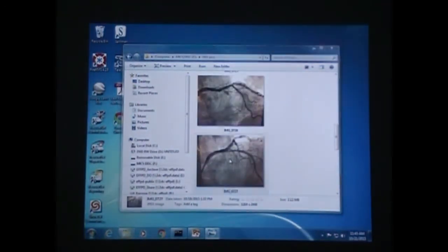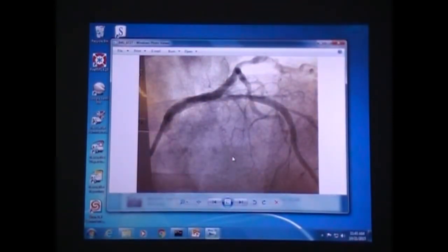So here's another angle, and it's really hard in the cath lab because you think that patient's laying on the table flat, and then our tube is rotating around them. So every angle can look slightly different, but what we're trying to do is get a good visualization of it. Because if we're shooting from one angle, it can look fine. We rotate and we can see that it's actually occluded on the bottom or the side or whatever. So we'll shoot numerous angles of each vessel.